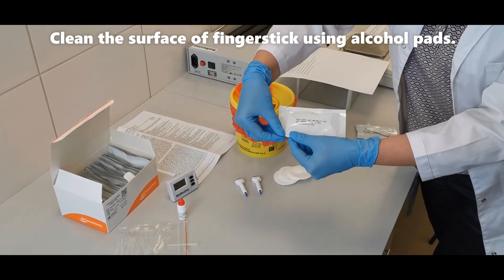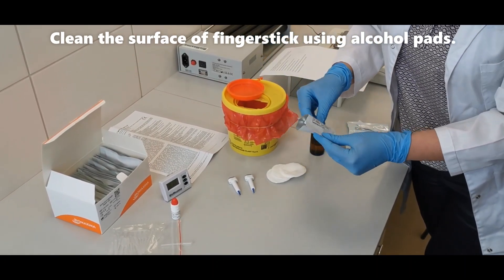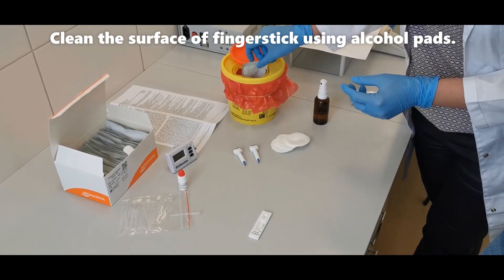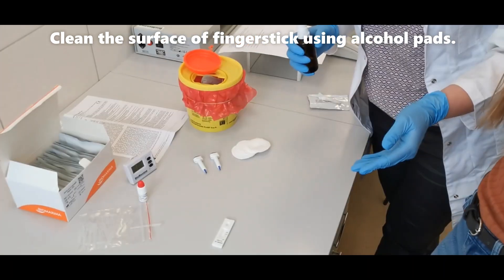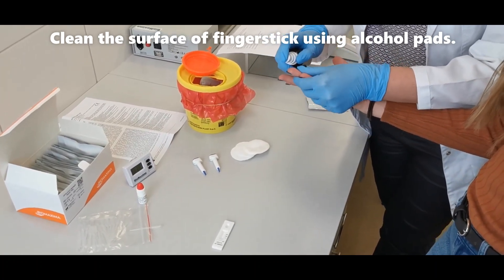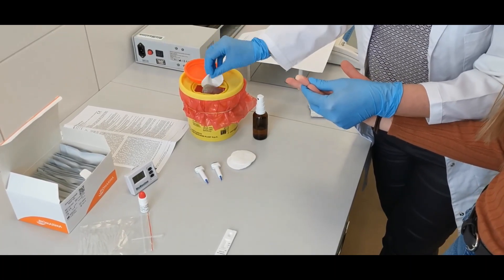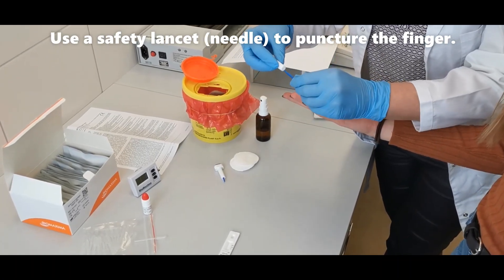To perform the test, first prepare the test cassette. Then clean the surface of a finger stick using alcohol pads. Use a safety lancet or needle to puncture the finger.